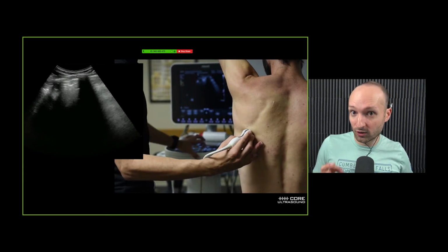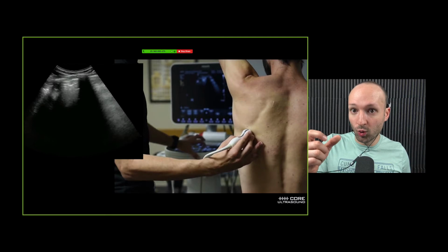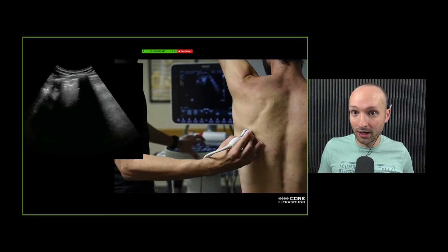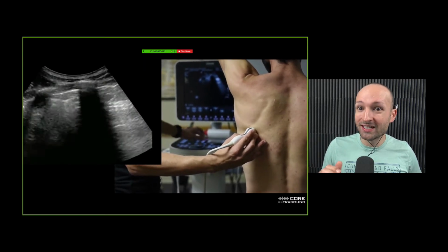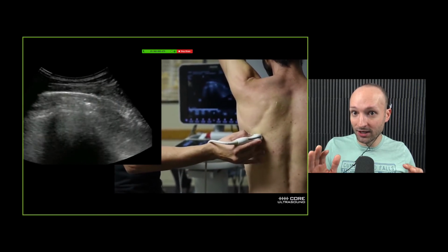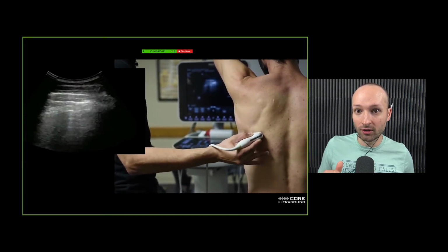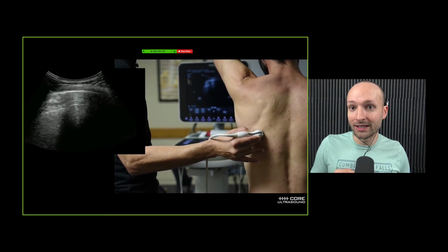So what I do there, I identified this one spot. It's kind of like I've been using the coarse tuner on a microscope. And then when I get to a section where I find an abnormality, I will actually turn the transducer to be parallel with the intercostal space. So now I'm getting the whole area in that section, that whole intercostal space, and I'll fan back and forth within that intercostal space and really look more diligently in that area.